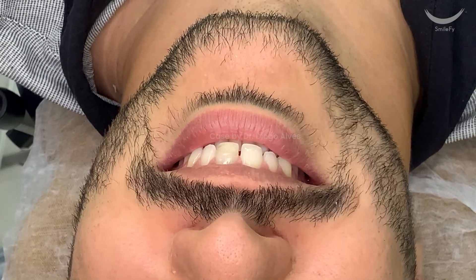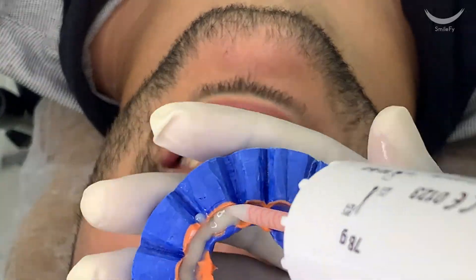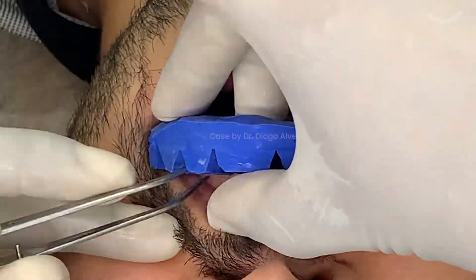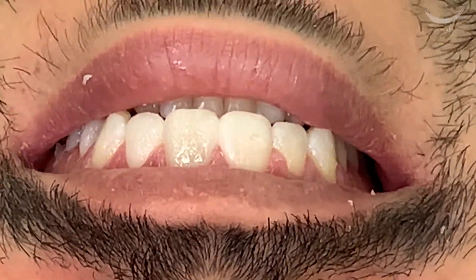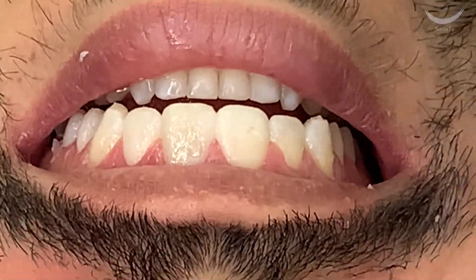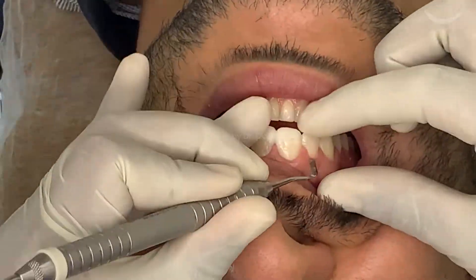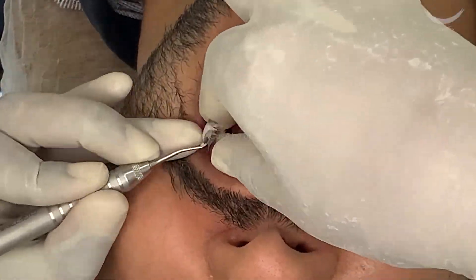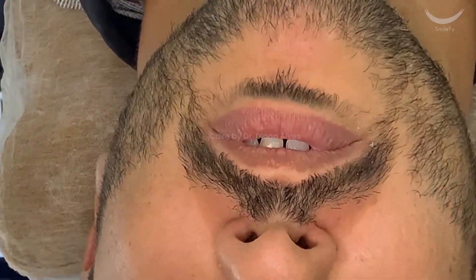On the patient's second visit, we decided to do a mock-up trial prior to delivering the final restorations. We created a silicone index, and with a bisacryl we applied the mock-up on the patient's mouth for a smile trial. Due to the root canal the patient had previously, we decided to use a lighter shade on that tooth to match the other restorations. Once approved by the patient, we removed the dental mock-up and started with the actual treatment.